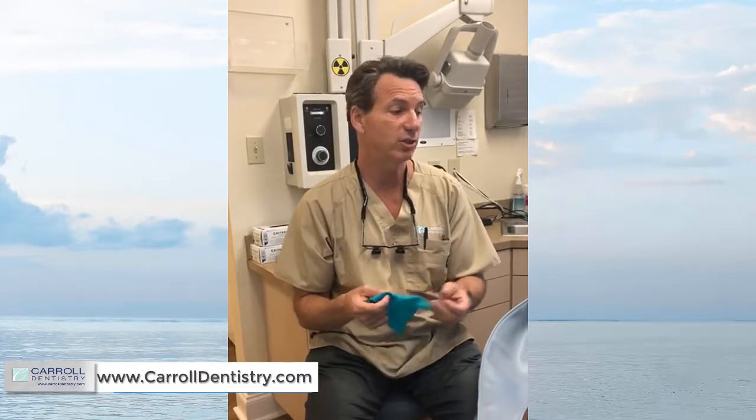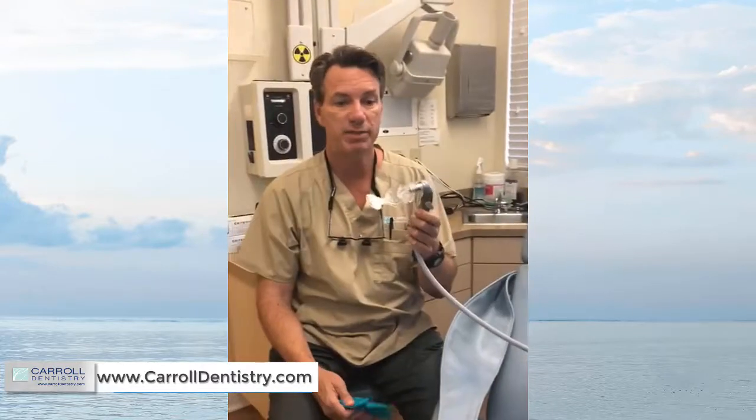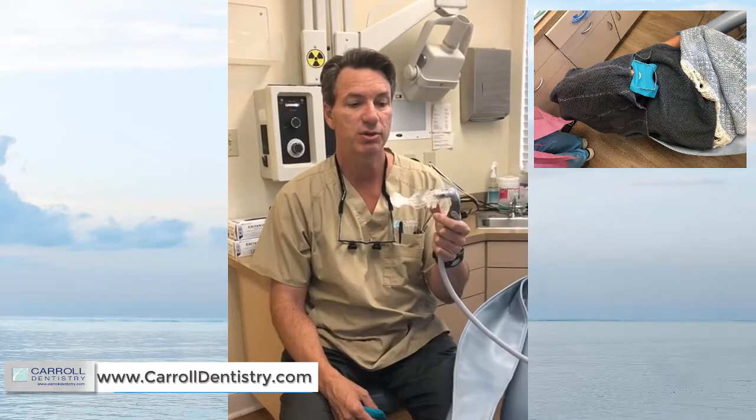If we go to a different isolation system like Isidry, it's a great backup system. It can give you a mouth prop for patients who fall asleep during long procedures — which they often do when we isolate and drape them. It's a great system for controlling saliva. It is our secondary and backup system for when we don't use rubber dam, are struggling with rubber dam, or simply don't want to use it on a particular patient.